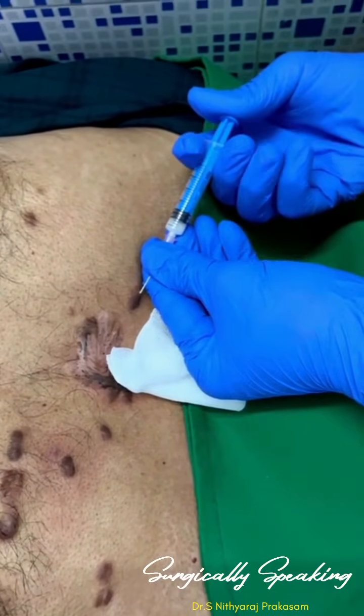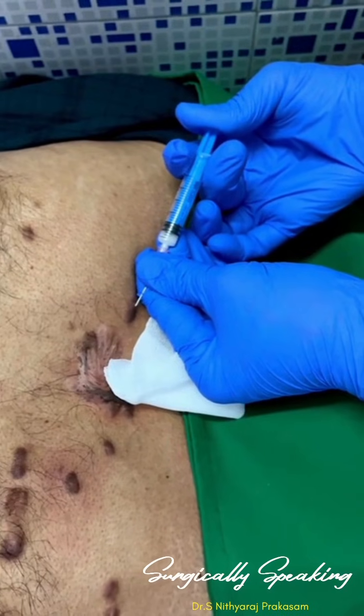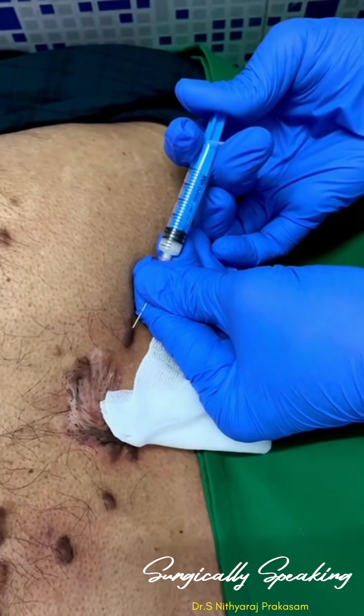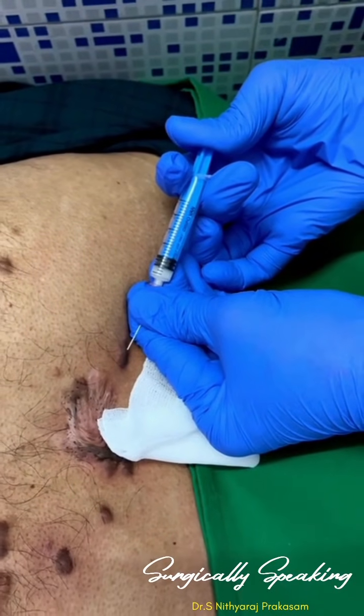Keep reassuring and be very gentle. Don't ever be in a hurry. If you are in a hurry, you might be injecting in the wrong plane, and it is a waste of injection. Okay, you can see the amount of force I'm using.